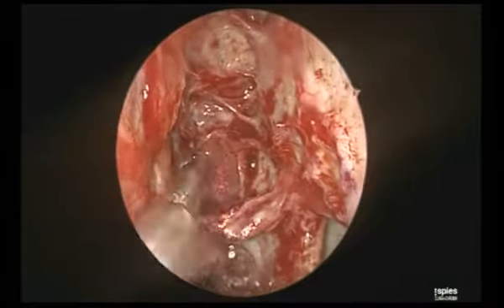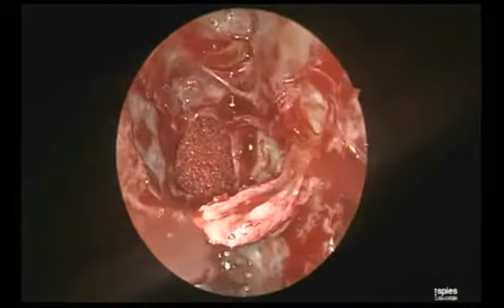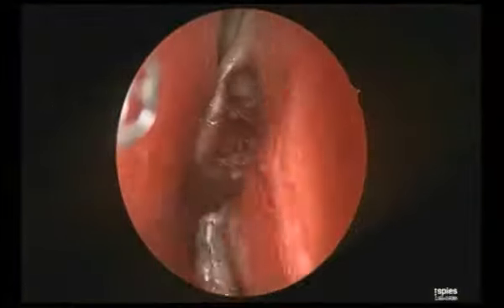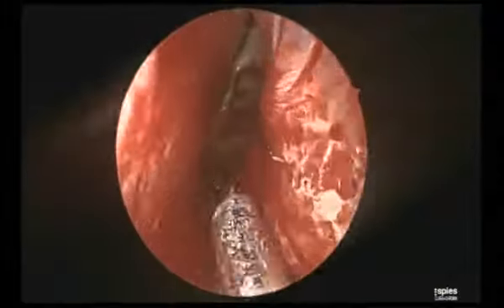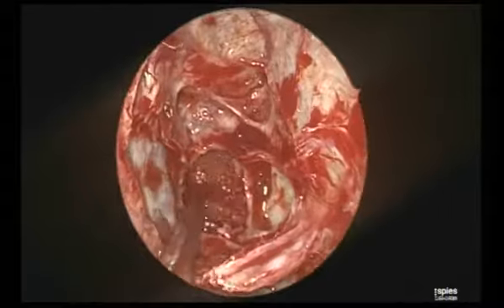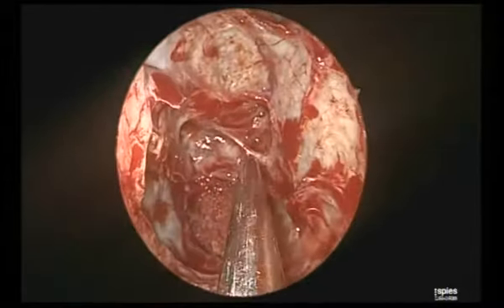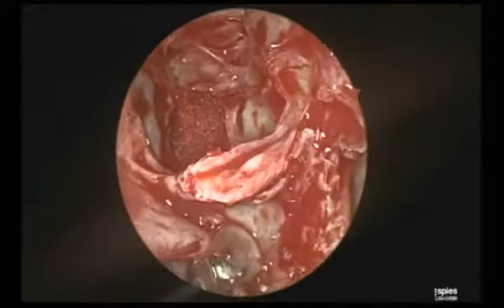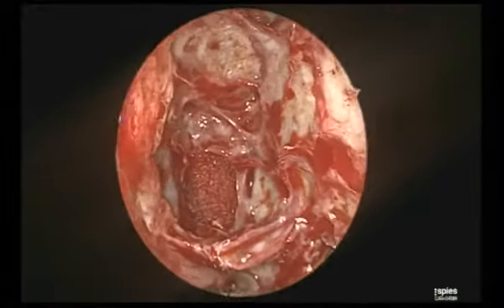I told you that's the area which contains tigers all around. Not blindly, now that we are seeing it, yes, I do that. In my practice, many times I use a micro debrider here and there in the sphenoid, but absolutely under vision. You need to know what exactly you are doing, otherwise it can lead to a disaster. Now see this, my widening of the sphenoid. This widening I need for my irrigation to reach.